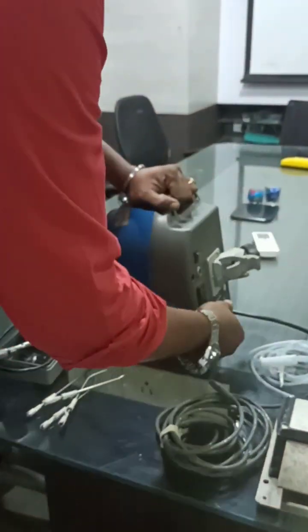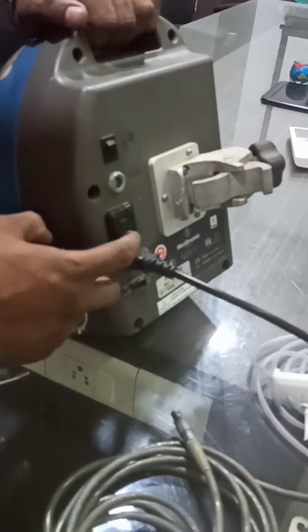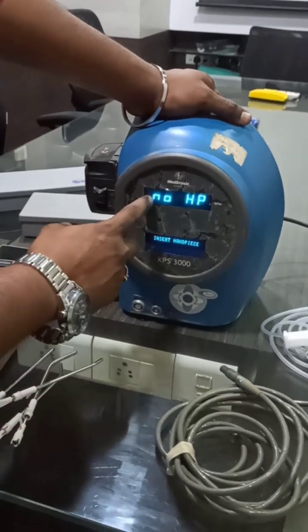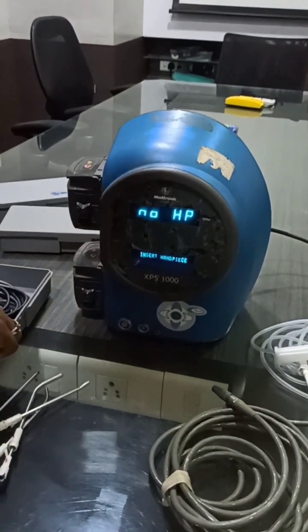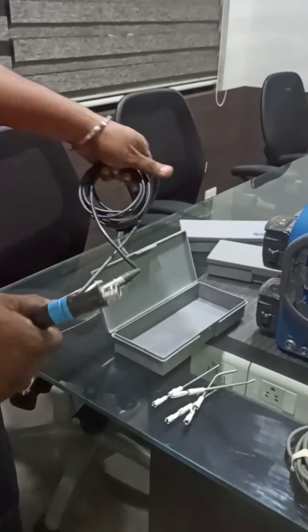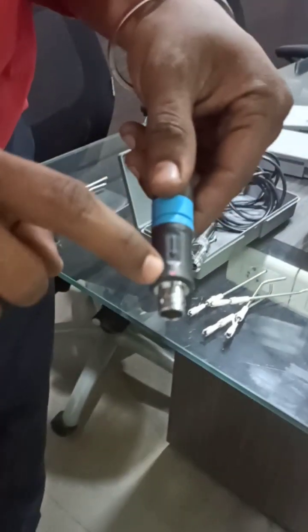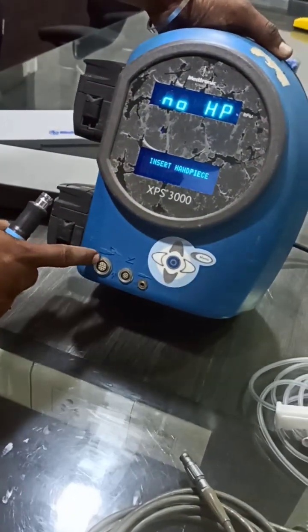First thing — at the back you have to connect the power cord. Just connect the power cord and then switch on this button. Once you switch on this button, the display will come automatically. If the display shows 'No HP', that means no handpiece is connected. The console is capable of connecting M2 and M4 handpieces. In the handpiece you can see an arrow mark and a red dot. Same way, inside the console also you have a red mark — since it is a very old console, the mark is not very clear.